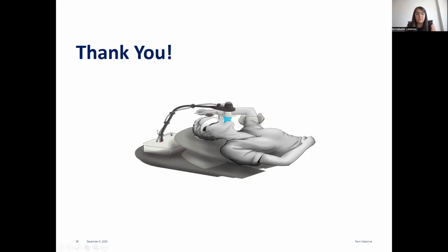The gooseneck of the SDX can bend and turn. So it can turn to the right, and it will have the patient turn their head to the right with it and brings their chin up actually a lot nicer. So you still do get that clearance. It actually helps with keeping the patient's head, neck, and chin up, and makes it easier.